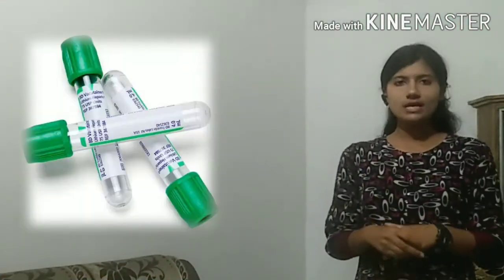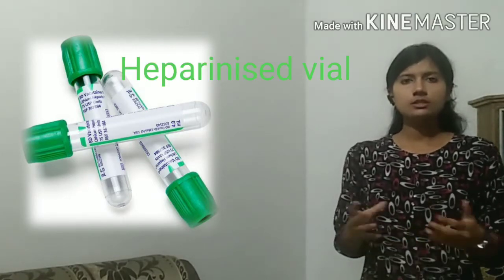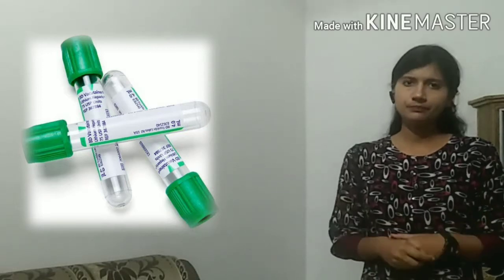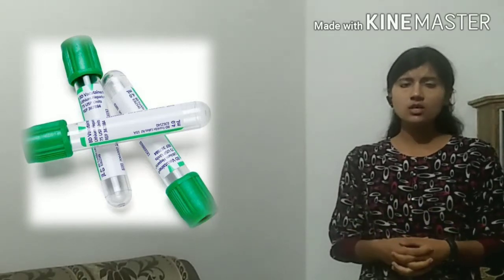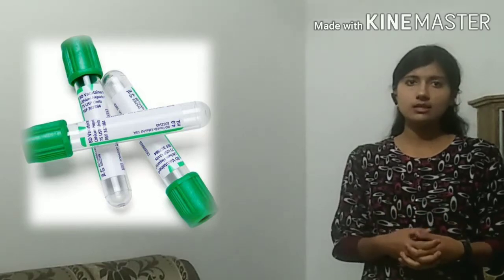Fifth vial is green vial. It is also known as heparinized vial. It is a less commonly used bottle for biochemistry. The additive present in this vial is heparin. Uses of green vial. It is used for conducting arterial blood gas analysis, liver function test, checking levels of sodium, lithium, ammonia and lactic acids in blood.